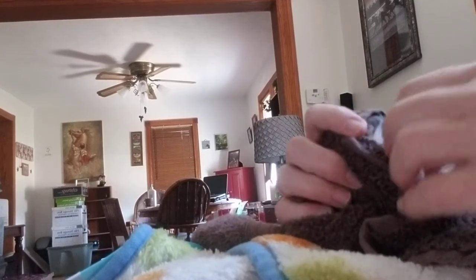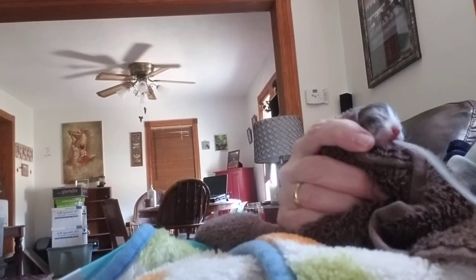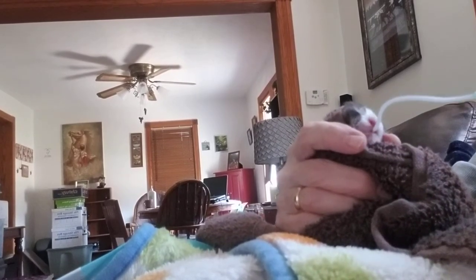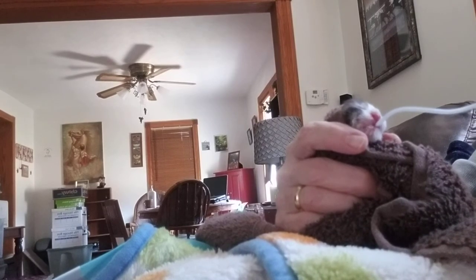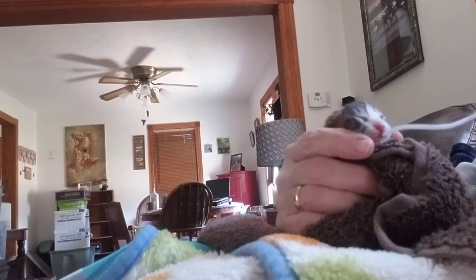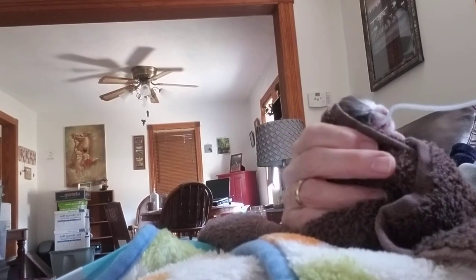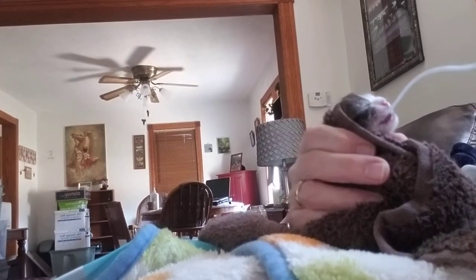So let's get it up here. No, you're not going to pull it out. I know it's not comfortable for him, but when they're not gaining weight and not suckling very good. So I'm inserting a little bit at a time into the stomach area.